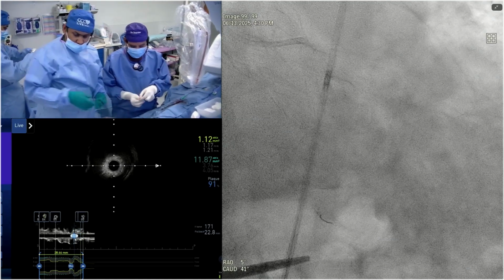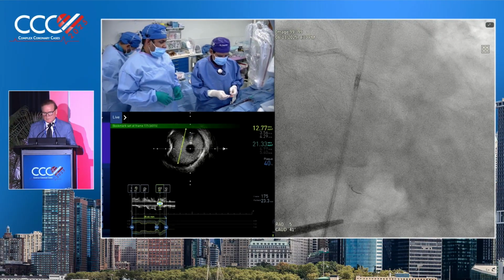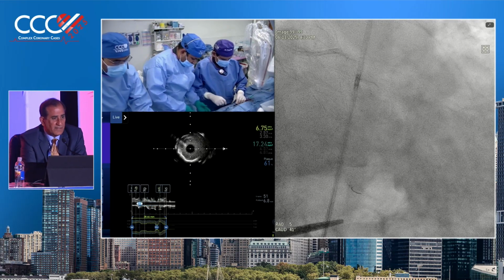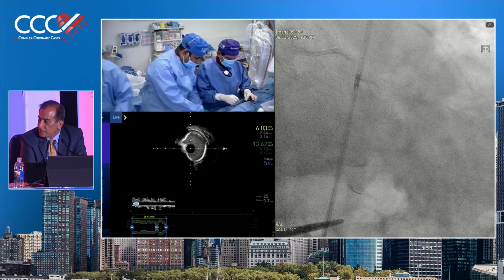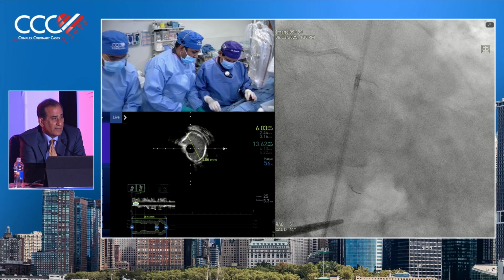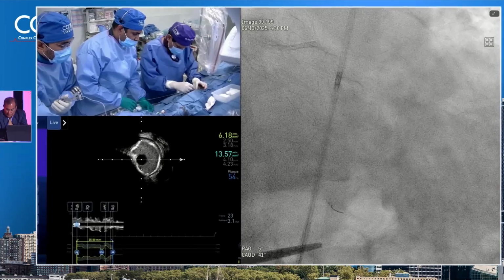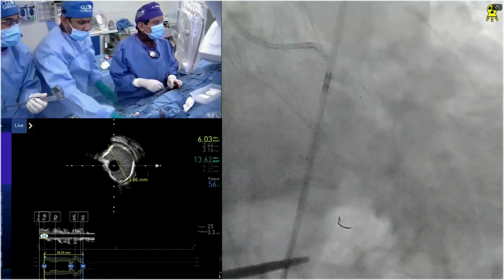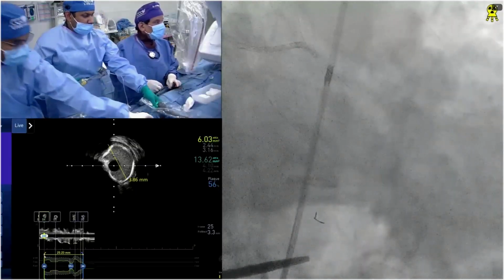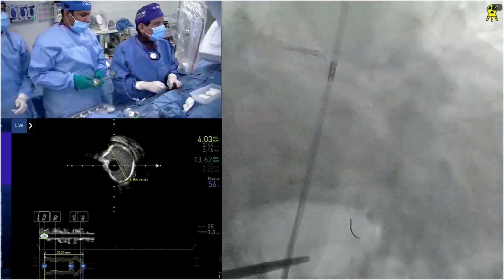Yeah, I think this is going to be educational in many ways, but I think the best teaching part of the case has already been established. Dr. Babar just showed a slide that 15% of the operators are using imaging. Just imagine if without imaging you would have just entered the left main and probably gone totally wrong. Yeah. So the question is a very good point. So before we became so, I would call it gung-ho on this imaging, what we could have done with this kind of a picture is try to do Rota off the left main. Circ is the tight lesion.